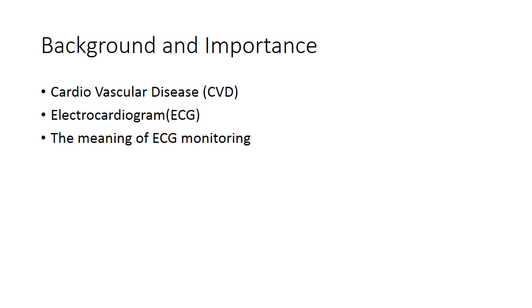While for electronic detecting, the most obvious characteristic is recording all the cardio information for a relatively long period of time. This causes another problem: there is so much information that a doctor can't analyze it on their own. In this way, electrocardial signal analysis takes too much time and effort.